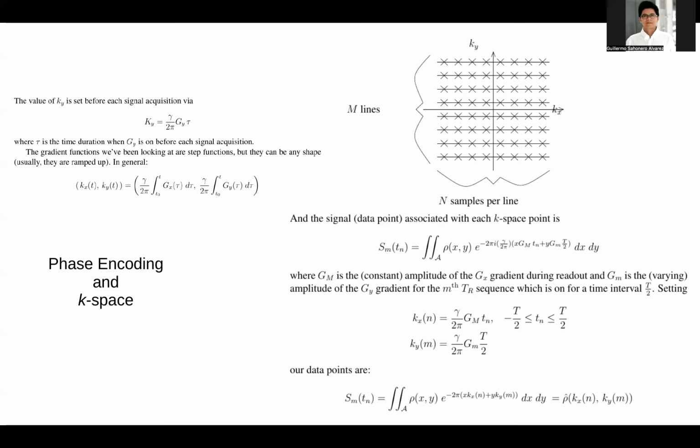I have seen in some other textbooks and practices that the sample should also focus on the origin of the K-space. And in this illustration, you're avoiding the center. So I'm wondering whether there is a particular opinion of yours that can provide any insight of why we should sample the center of the K-space, or why we shouldn't, or why it could be avoided without any negative repercussion. In fact, you should center the origin of K-space because that's where you're going to get the most signal.